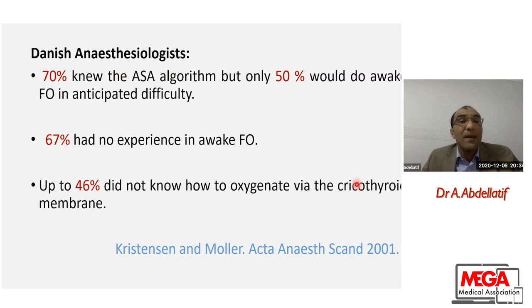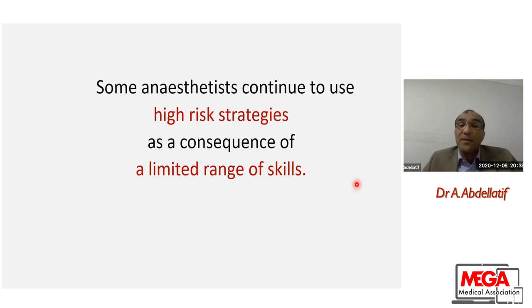This survey was done in Denmark. They asked the Danish anesthesiologists some questions, and 70% knew the ASA algorithm very well, but only 50% would do awake fiber optic in anticipated difficulty, and 67% had no experience in doing awake fiber optic, and up to 46% did not know how to oxygenate via the cricothyroid membrane in case of an emergency pathway. So some anaesthetists continue to use high-risk strategies as a consequence of a limited range of skills.